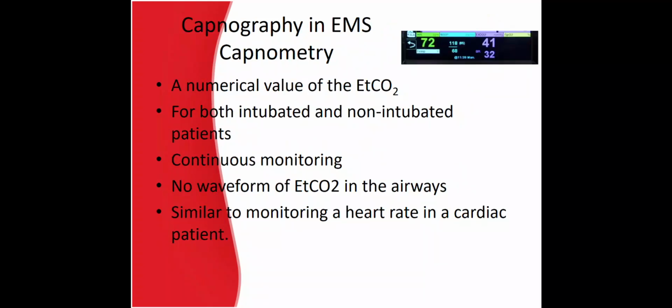Capnometry gives a numerical value of the end-tidal CO2 for both intubated and non-intubated patients. It can be used for continuous monitoring. However, there is no waveform of end-tidal CO2 in the airways. It's similar to monitoring a heart rate in a cardiac patient without seeing an ECG rhythm.